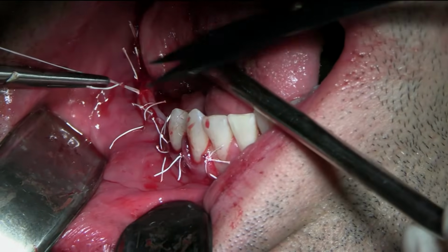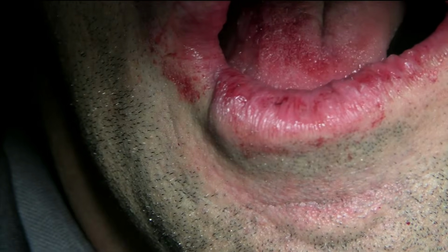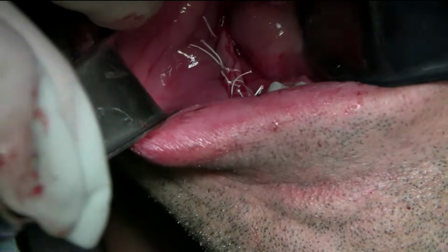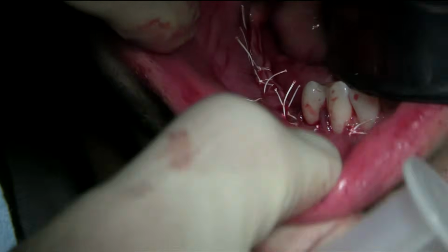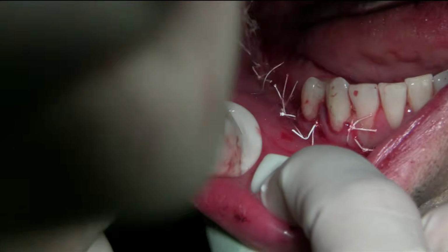Okay, cut. So we're slowly but surely there. Okay, I need another suture. Tatiana, I need another suture. Okay, let's check. Let's irrigate. Okay, just with your finger, just irrigate. Okay, tongue.